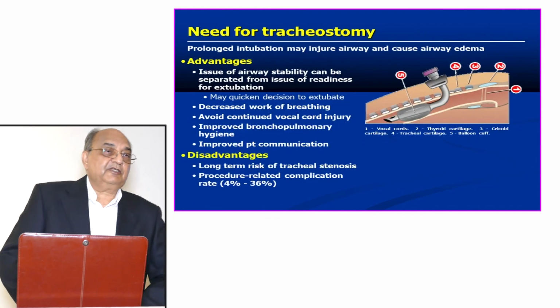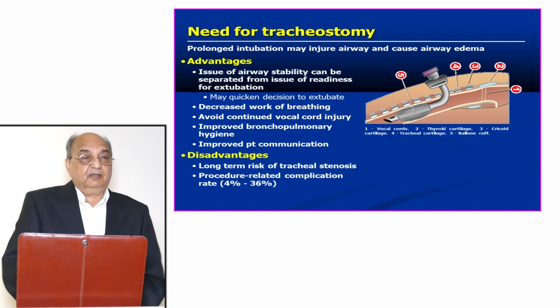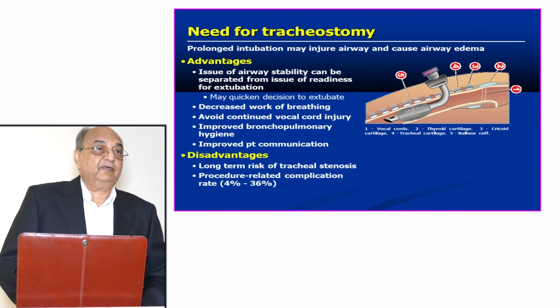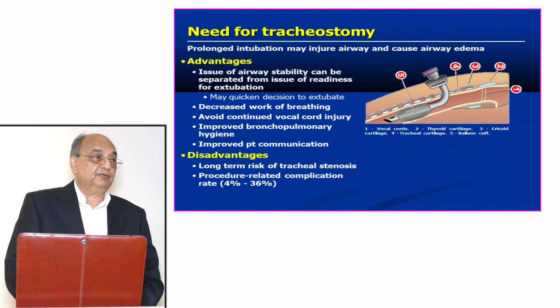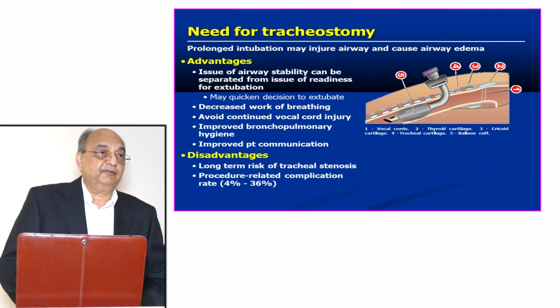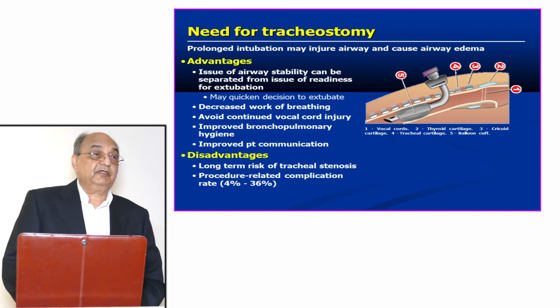Tracheostomy. Now the patient is intubated and on a ventilator. Now you will have to judge. A standard rule is 7 to 10 days. If that has passed and the patient is still on the ventilator and the tube is in, you should choose, that's the indication to do the tracheostomy. And if you plan that the patient will be needing prolonged ventilation or prolonged intubation, to avoid the complications of intubation, you do the tracheostomy and put them on that.